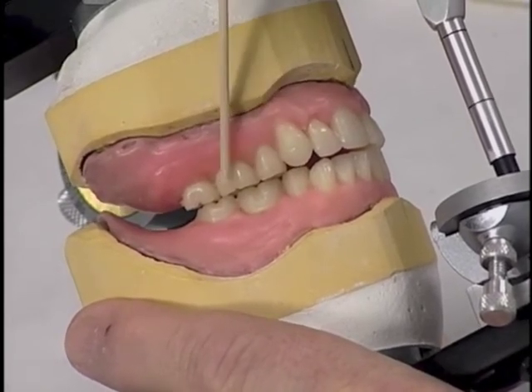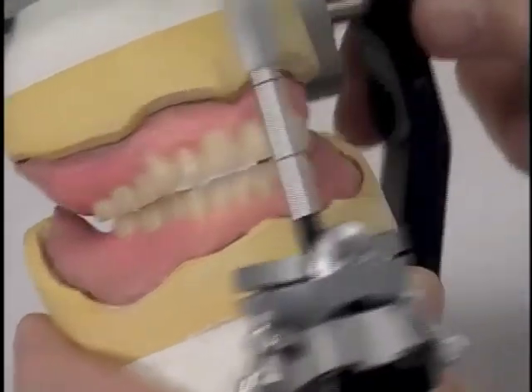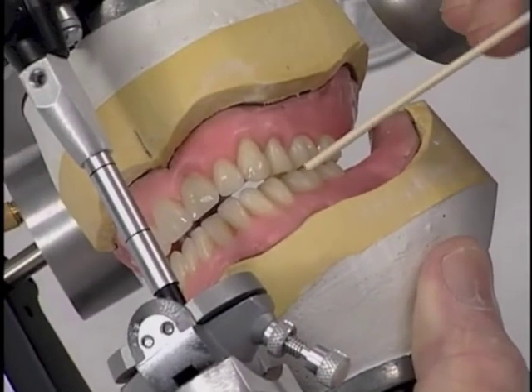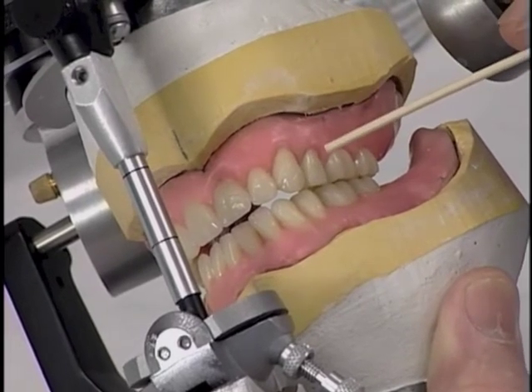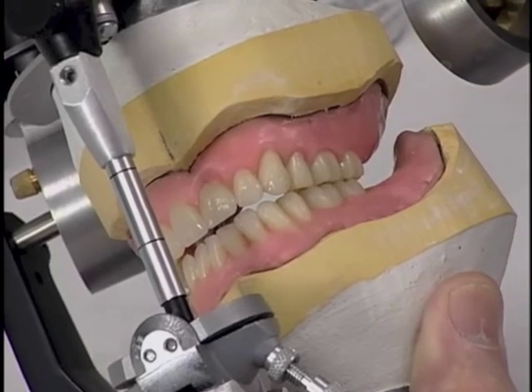That's a second premolar and 2 molars in each quadrant. And we have the same arrangement on the other side with 2 to 3 millimeters of horizontal overlap and 3 posterior teeth, those being second premolars and 2 molars in each quadrant.